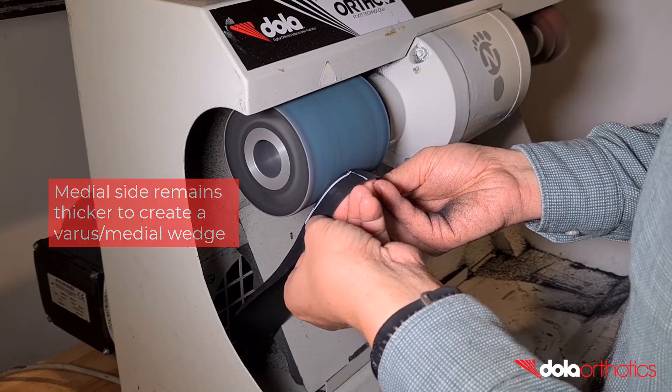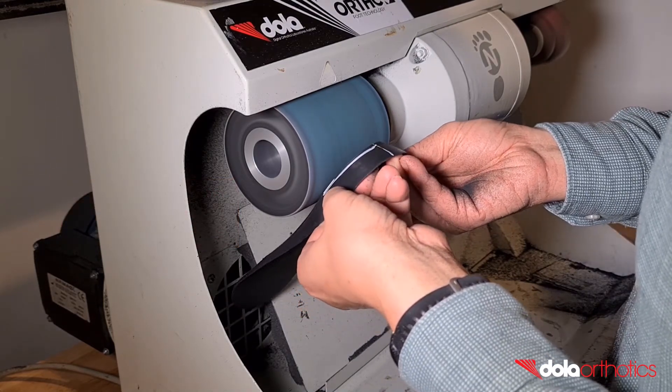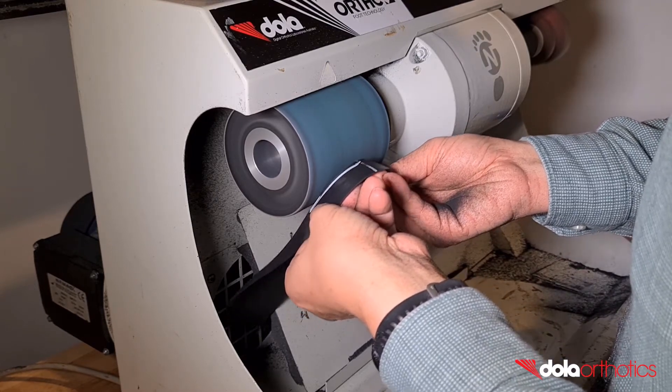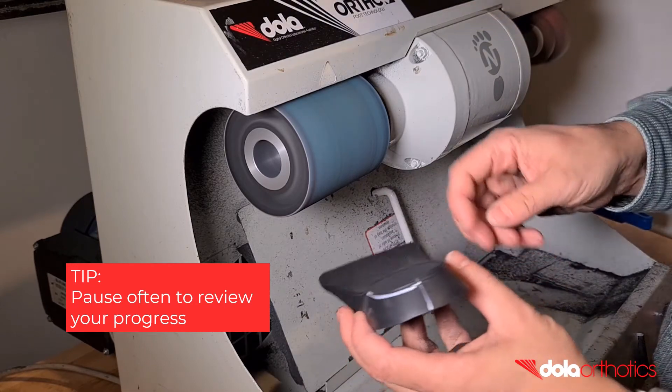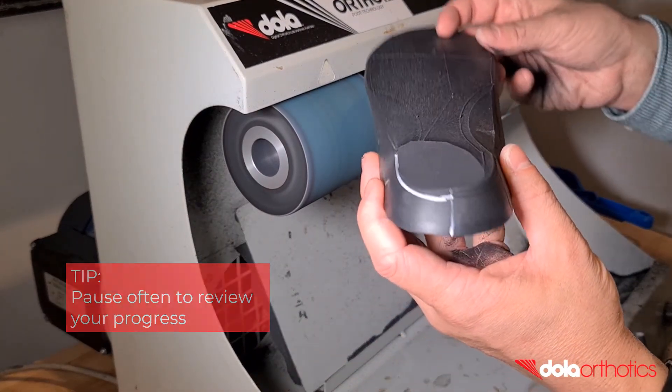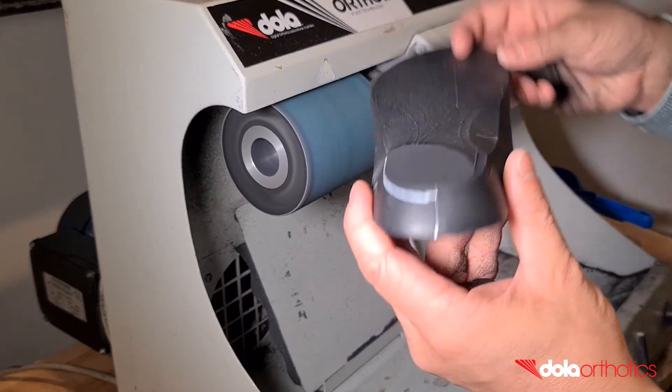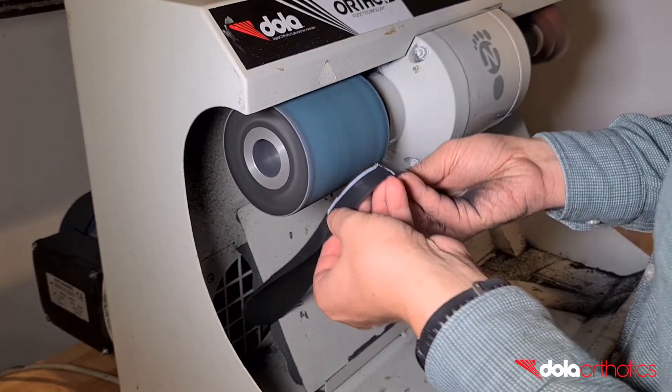Remove small sections of the orthotic at a time until you become comfortable, and check your progress against your guideline. The orthotic orientation chosen in this video allows visualisation of the guideline. Alternative options include rotating the orthotic, which may also assist in the ergonomics and ease of this modification.